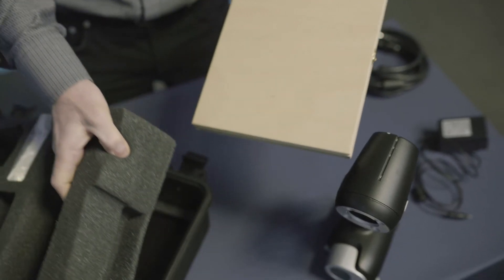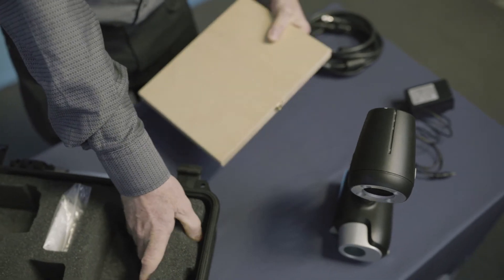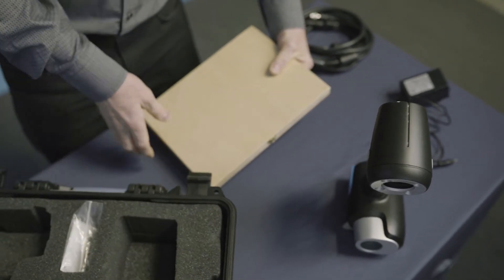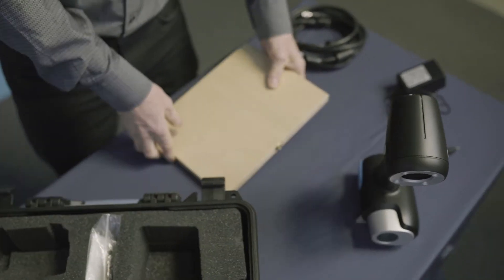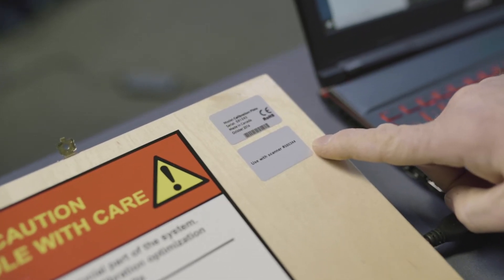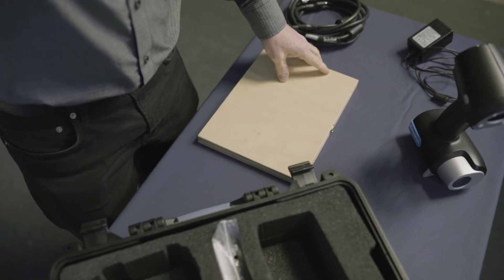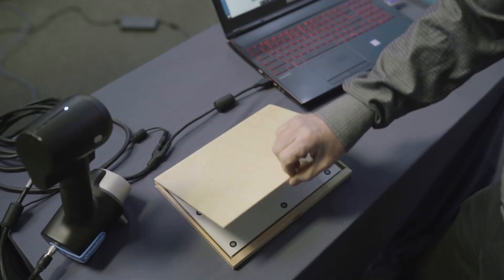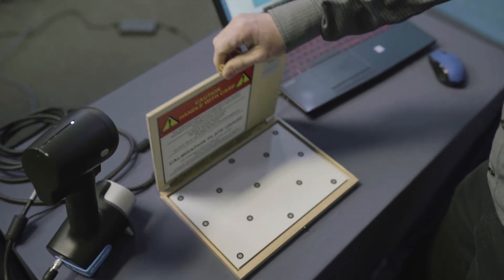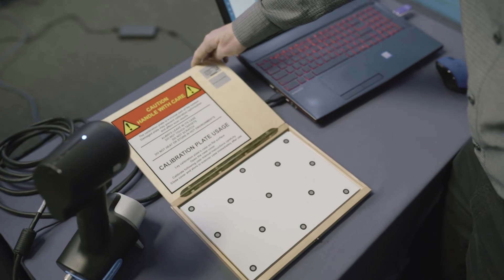Next, you will need the calibration plate included with your body scan scanner. Make sure the serial numbers of the body scan and the calibration plate match. Open it and lay it on a flat surface, like your desk, for example.